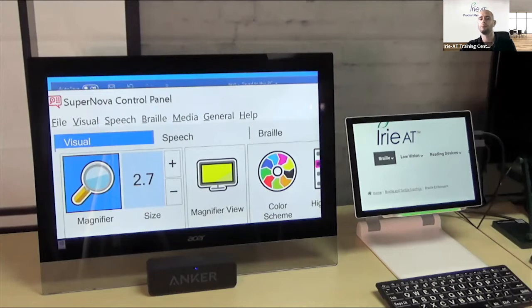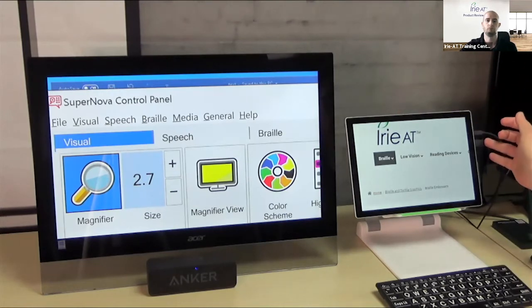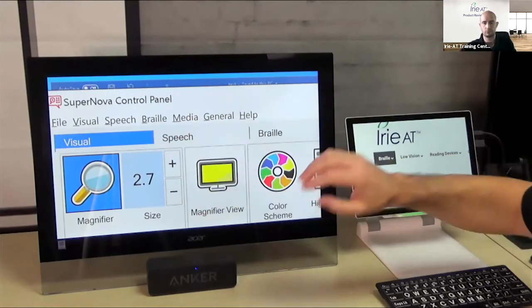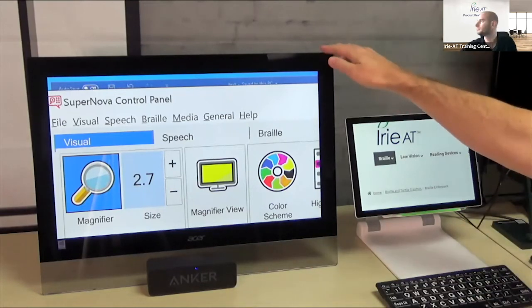Is the large touchscreen you are using connected to the Surface via DP only, not using USB 3? Now, every touchscreen that I know of uses... I haven't used a USB-C touchscreen. I would guess that with USB-C, you only need that connection because that'll carry the USB signal and the video and power and everything else. In this case, this is an older monitor, and this is an older Surface that doesn't have a USB-C. So I have a USB dock connected in, and then that's connected to control this as a mouse. And then the mini DisplayPort connection is running the video. It should be running the audio, but it wasn't, so I put this Bluetooth speaker here. So this is an ancient old guy.